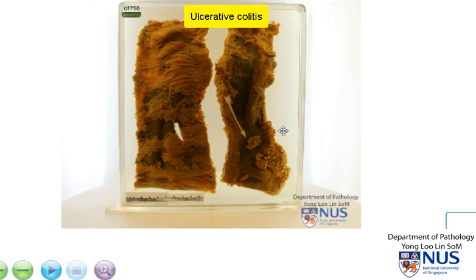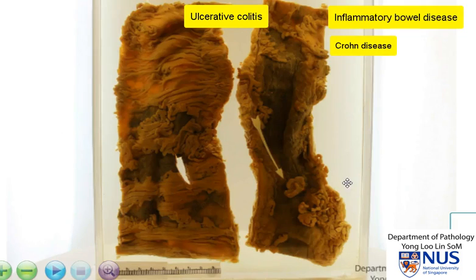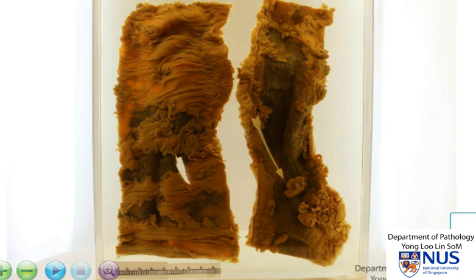Ulcerative colitis is one of the two major types of inflammatory bowel disease, the other one being Crohn's disease. It is important to examine the pseudopolyps or any polypoid areas that appear a little bit different from the other areas because there is a significant risk of developing malignancy, adenocarcinoma, in ulcerative colitis, especially in long-standing ulcerative colitis. Let me show you another example of ulcerative colitis.